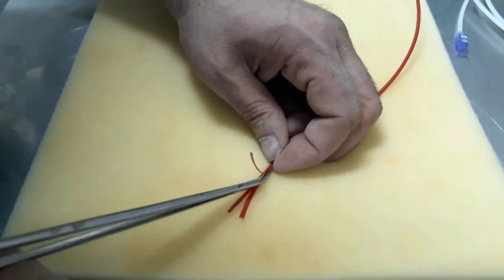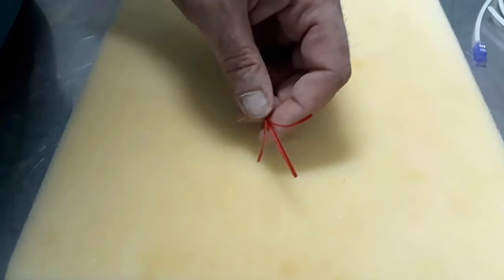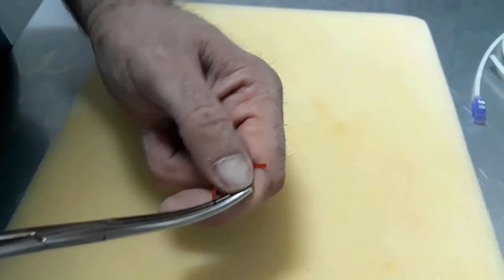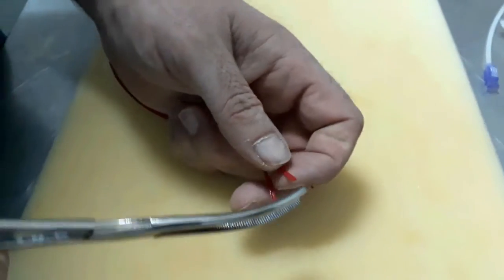Similarly, three prongs are cut with scissors. The tips of the three prongs are incurved medially.